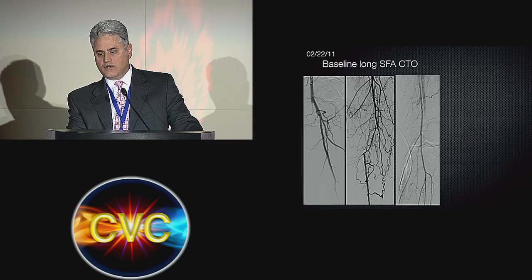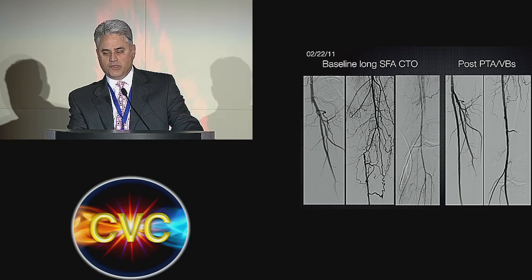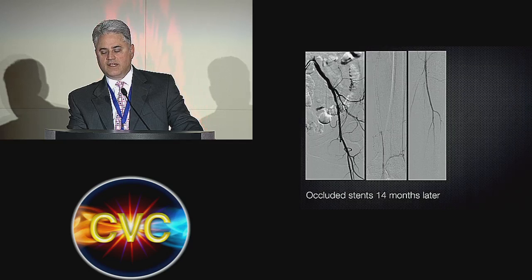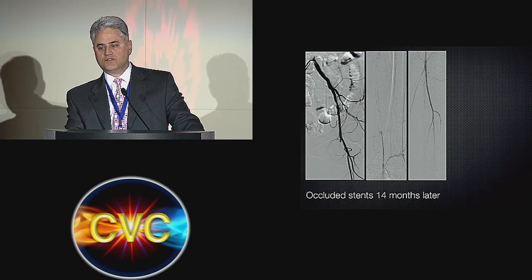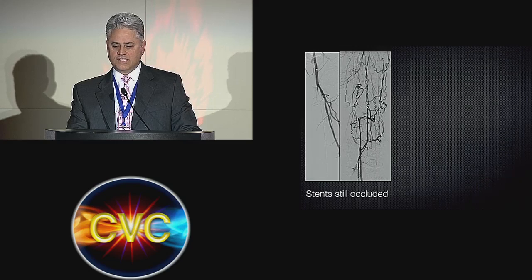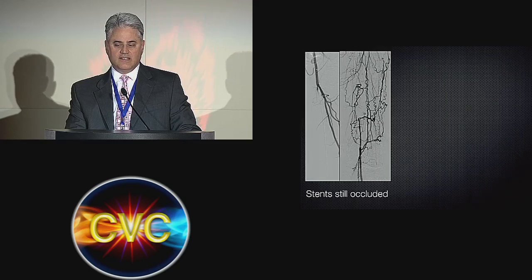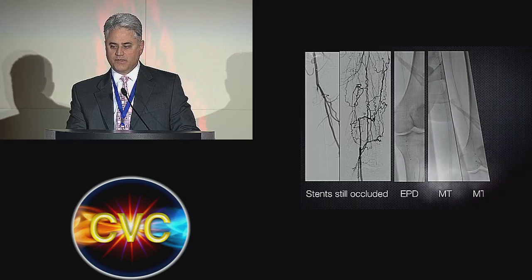So let me just go through a few real-life cases. This was a patient who had presented with a long SFA CTO in 2011, ballooned it, placed Viabahns. She did well. About 14 months later, she came back in, and her stents had been closed for a while. In this particular case, we treated her with ultrasound thrombolysis the next morning.